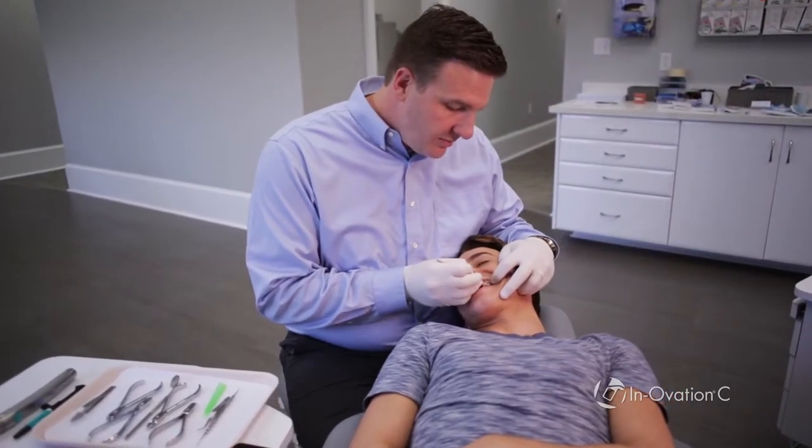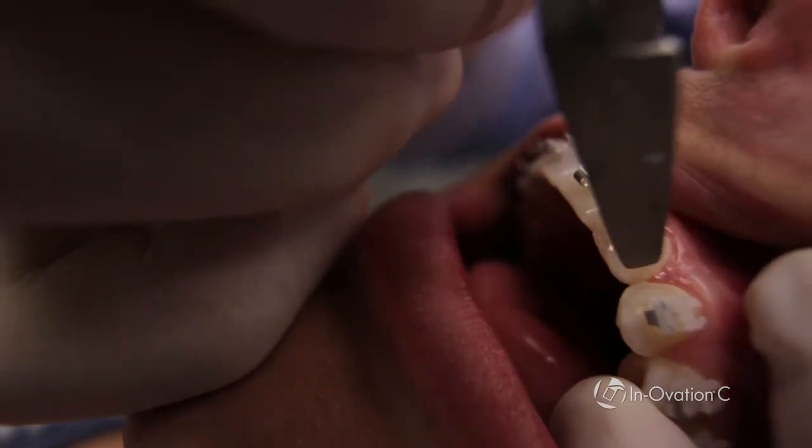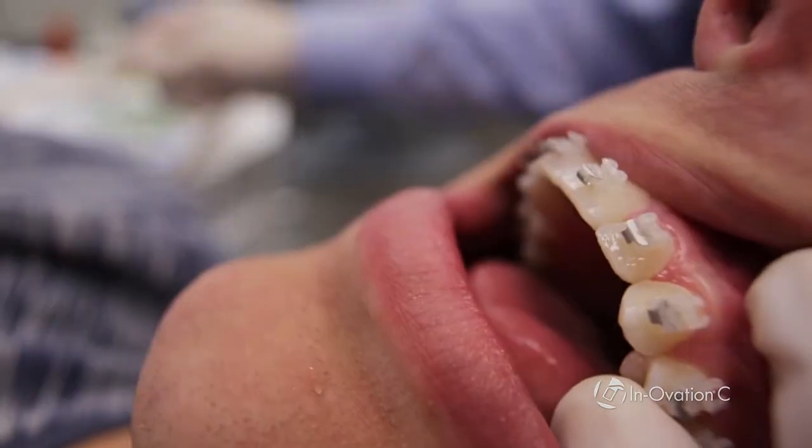The best thing about Innovation C from a practicing orthodontist standpoint is the fact that you can reposition the brace and be confident that the brace is usable a number of times. That's a big difference between Innovation C and other braces on the market.